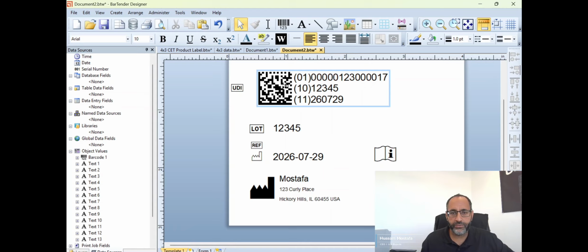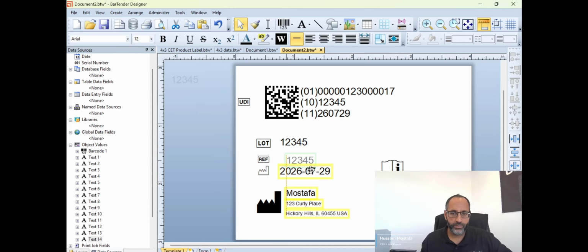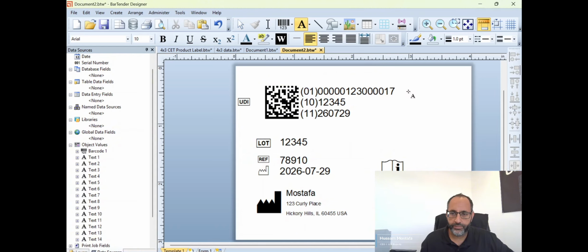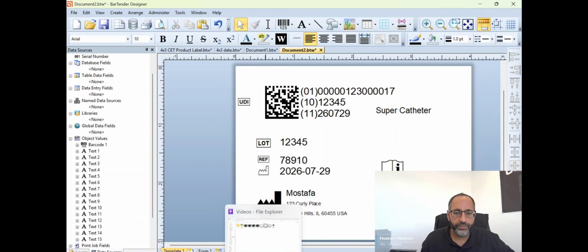All right, so we got the UDI 2D data matrix. The catalog number, we'll go ahead and put some catalog number in there too. 7, 8, 9, 10. Alright, then we have the instructions for use manual, the sterile product, MD for medical device. We could put in a device description. Call this super catheter. All right, and then we can even put like a logo in here. Grab the UDI Experts logo.